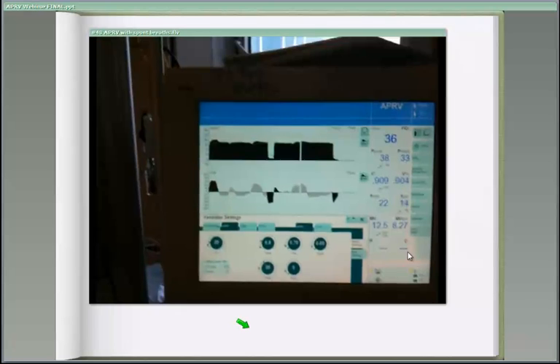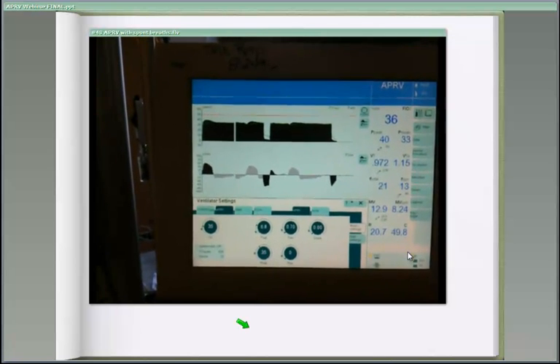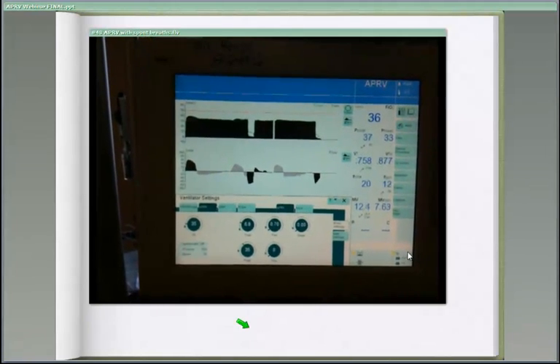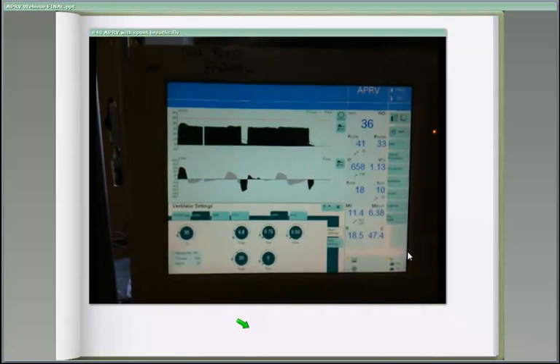This is a patient who's almost just under 300 kilograms, who's had massive resuscitation because of hemorrhage, has massive anasarca, and their transpulmonary pressure is likely to be significantly less because of the body habitus and the resuscitation they receive. So what this 35 is doing is actually creating a more compliant portion of the patient's ability to ventilate. And as such, it takes very little effort.